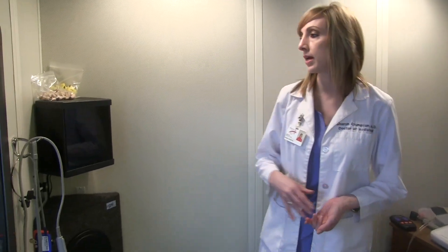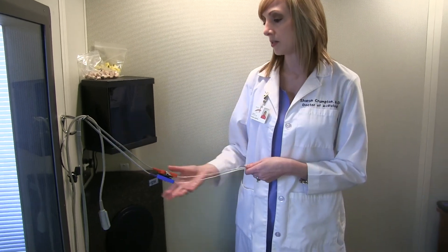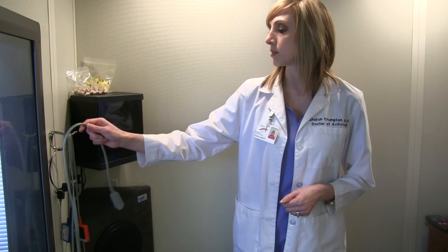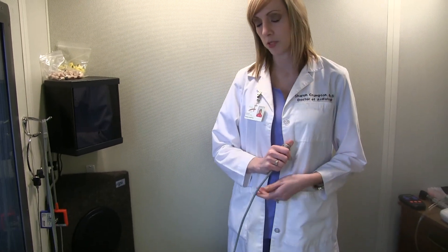The patients will be sitting here and my audiometer is on the other side of the window there. We'll put earphones in your ears and you'll hear a series of words and you'll repeat the words back. Then you'll have this little button here to listen for tones, and every time you hear a tone you'll push the button.